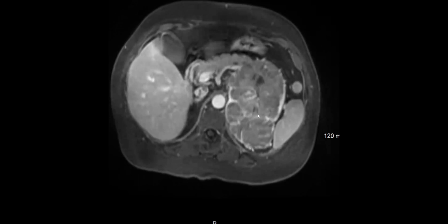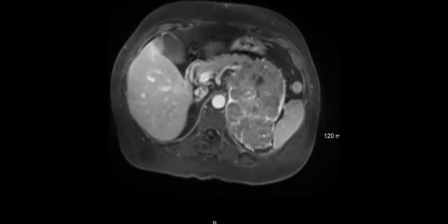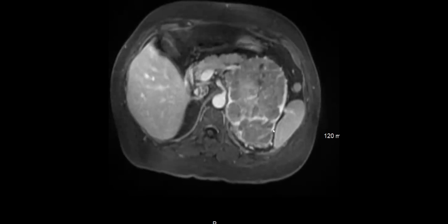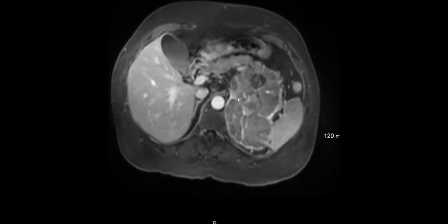And then they operated on this. This turned out to be an ACC. I was looking at, are there any MR features that can help us distinguish one from the other? And there are not. They say calcification is more common in adrenocortical carcinoma, but if you go by pure MR sequences, both can show necrosis, hemorrhage. They can both be very heterogeneous. And then any adrenal mass larger than 5 centimeters is considered malignant unless proven otherwise. And of course, there was a tumor thrombus extending into the vein as well.